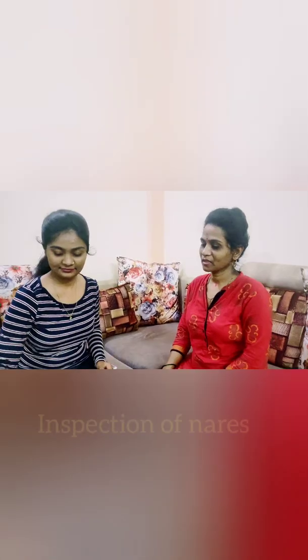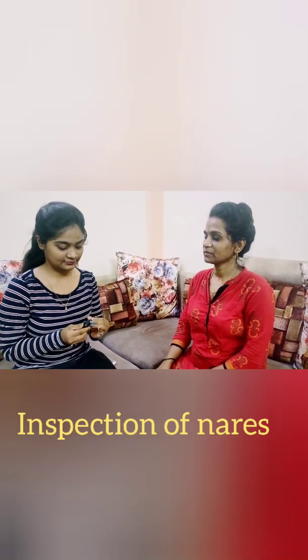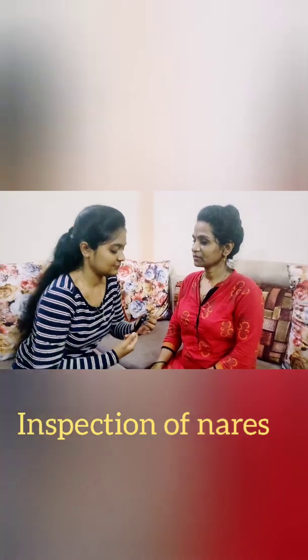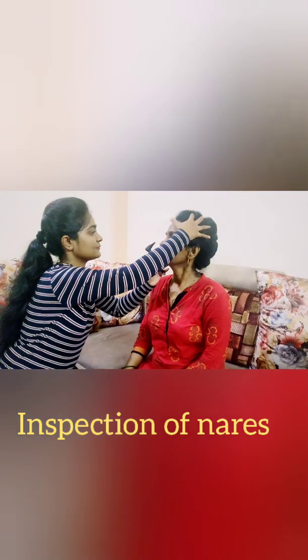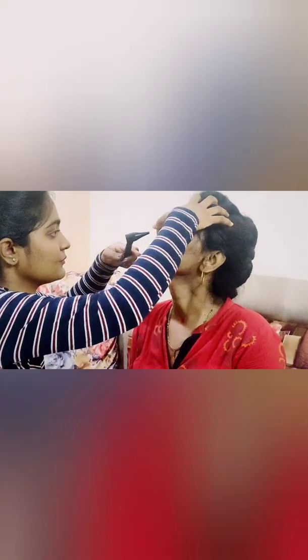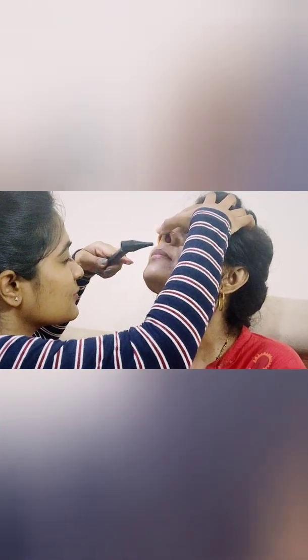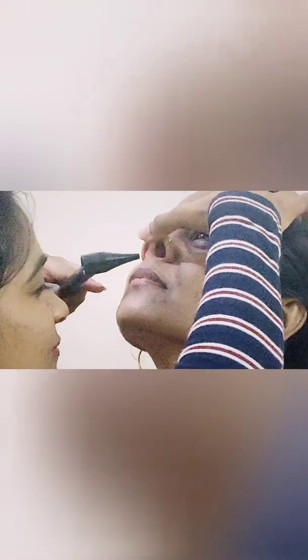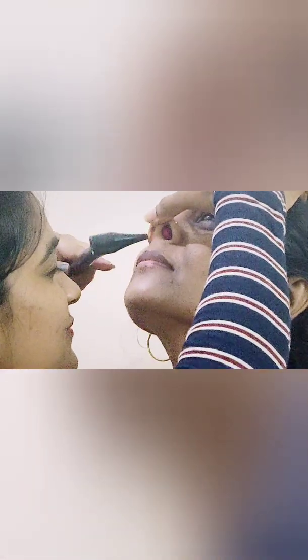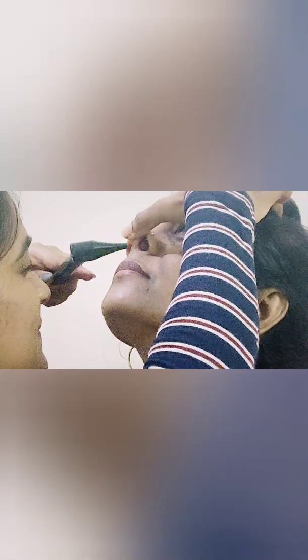Now I'll inspect the inside of your nares. Inspect the inside of nares with an otoscope and the largest available ear speculum. Tilt the patient's head back a bit and insert the speculum gently into the vestibule of each nostril to avoid contact with sensitive nasal septum. Hold the otoscope handle to one side to avoid the patient's chin and improve your mobility.